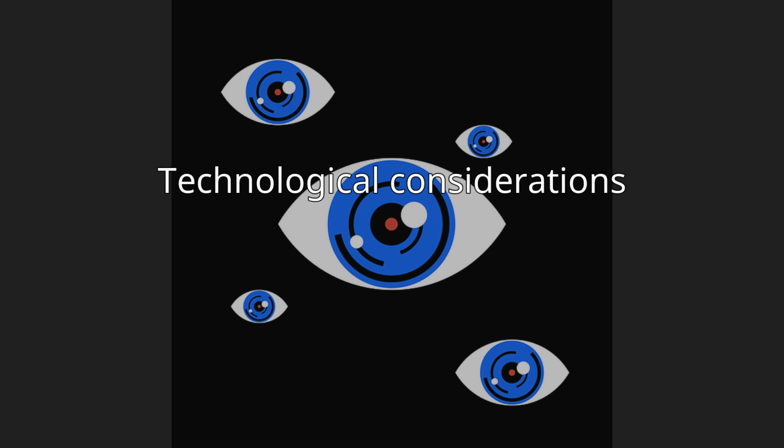Technological considerations. Visual prosthetics are being developed as a potentially valuable aid for individuals with visual degradation. Only 3 visual prosthetic devices have received marketing approval in the EU. Argus II, co-developed at the University of Southern California USC Eye Institute and manufactured by Second Sight Medical Products, Inc., was the first device to have received marketing approval, CE mark, in Europe in 2011. Most other efforts remain investigational.